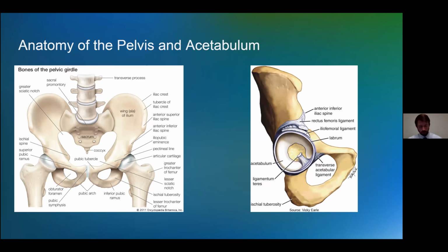So let's go over some of the relevant bony landmarks. Just of our pelvis here, the pelvic crest right along here, the ASIS is important to recognize. Moving inferiorly, the AIIS, and then our femoral head as well as our femoral neck here. And then our greater trochanter as well as our lesser trochanter here inferiorly. It's important when you're approaching the ultrasound to visualize where you think these structures are most likely to be on your patient.